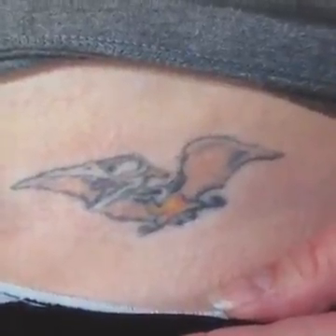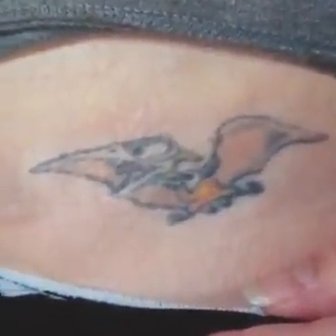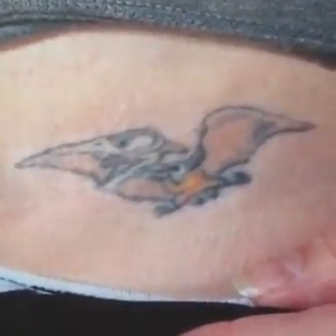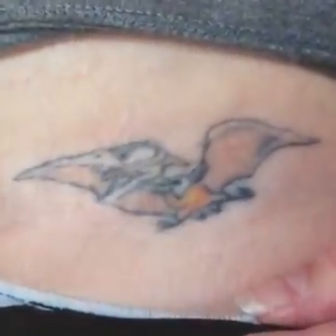So we are live about to do laser tattoo removal. This is a tattoo that we have treated one time. You're looking at a photograph of it before it was ever treated. Today, after one treatment, we already have these results, and she is about to get her second treatment on this tattoo.